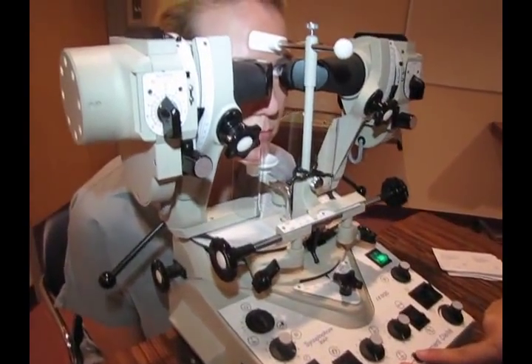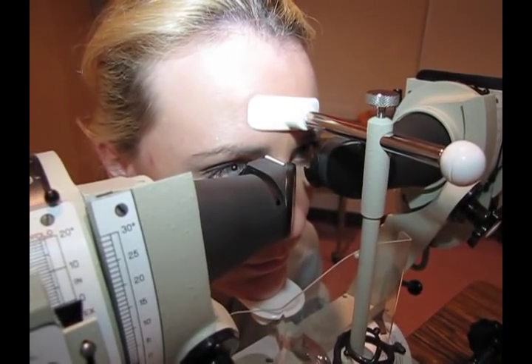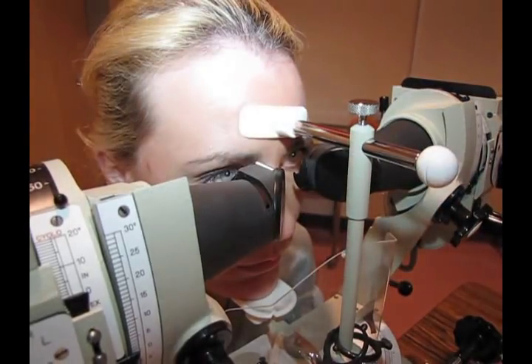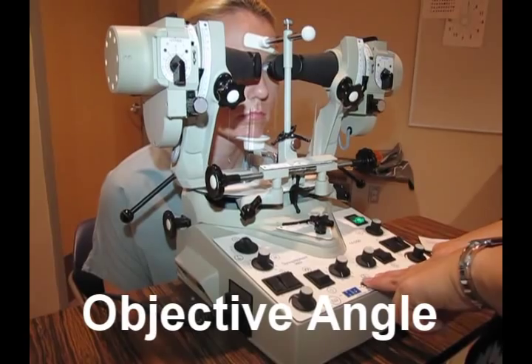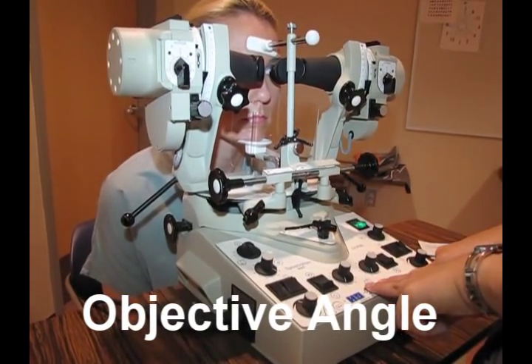And basically when I press the buttons, I'm going to press one, and I'm going to let go of the other at the same time. You want to make sure the lights are dim or dark, because you don't want extra light coming into the machine. Look right in the middle. Look. Ready, look.